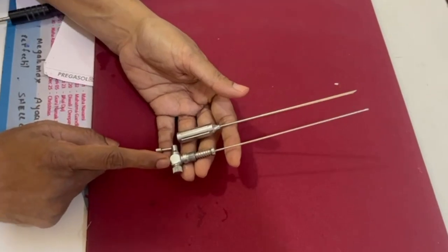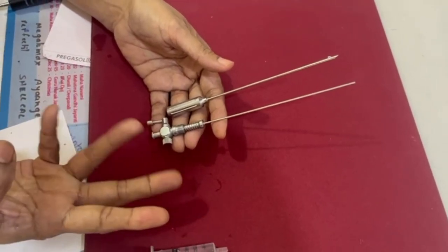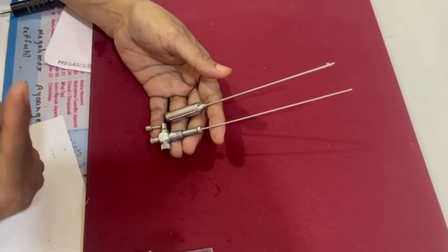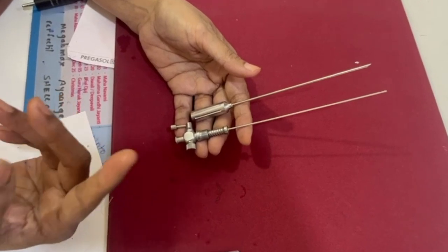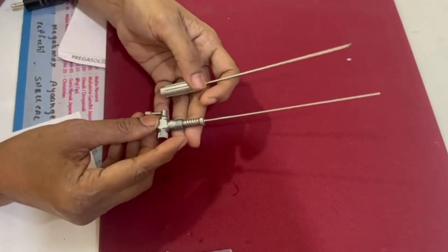This is the Veress needle. It is available in three sizes: 12 centimeter, 10 centimeter, and 8 centimeter. 12 is for the obese abdominal wall and 8 is for thin ladies. The parts: this is the outer one.